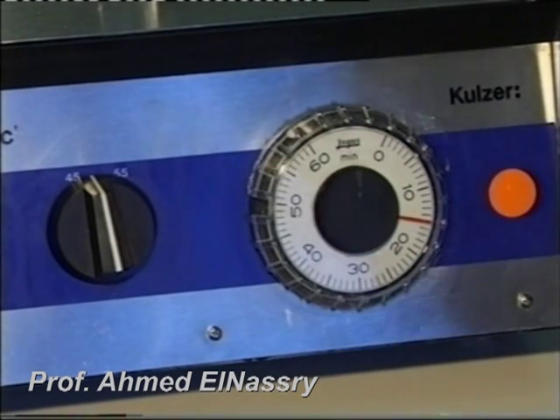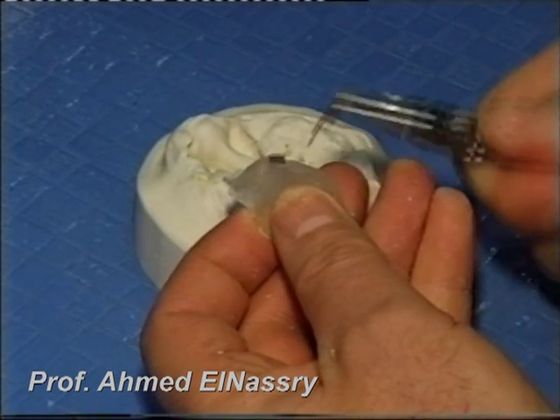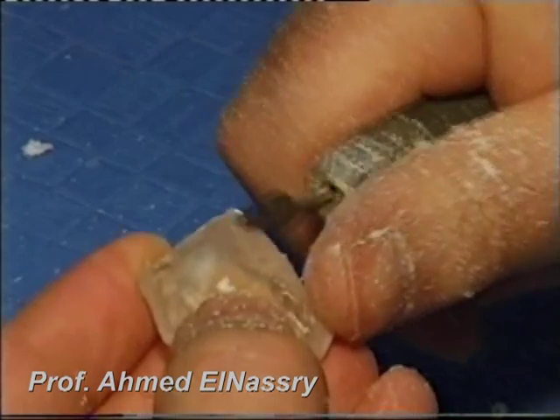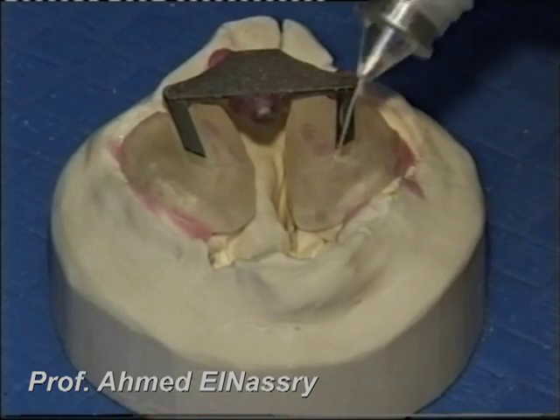Then we cure the acrylic. After curing, we remove the pin directors and finish the two acrylic parts. The next step is to insert the expansion screw.